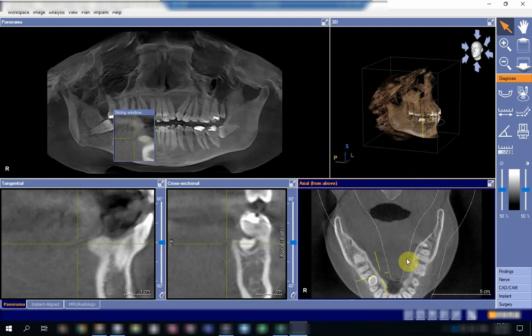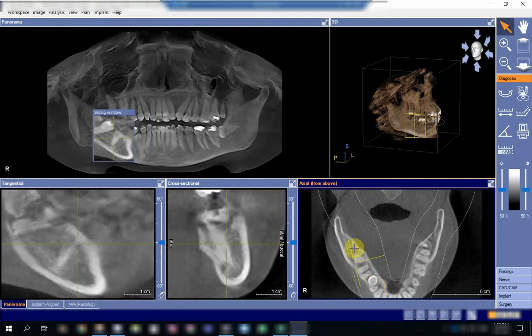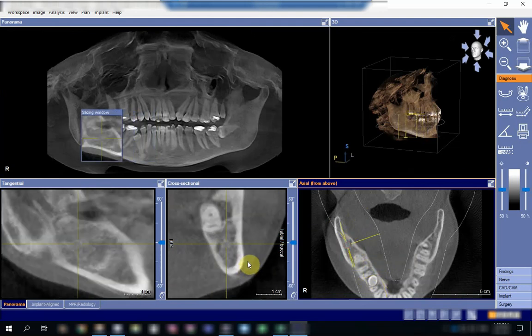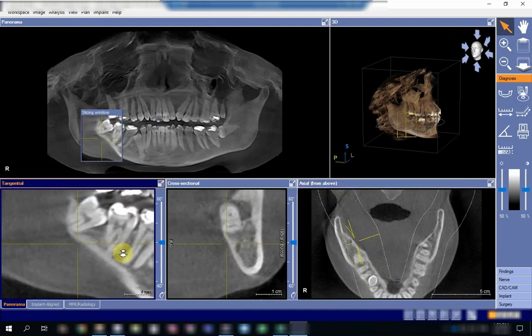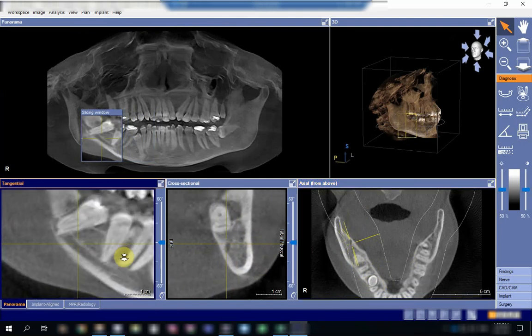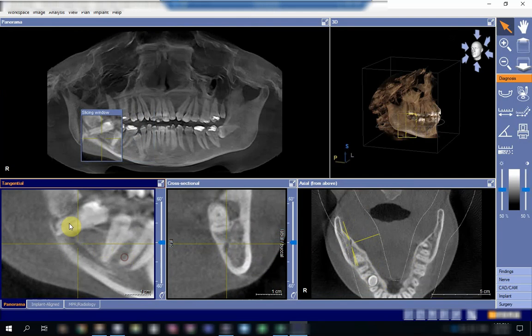The best views in the CBCT are the coronal and sagittal views, where you will have a better understanding of the course of the canal. Thank you very much.